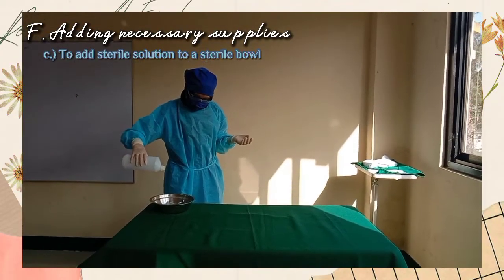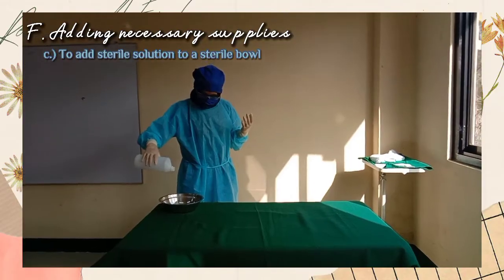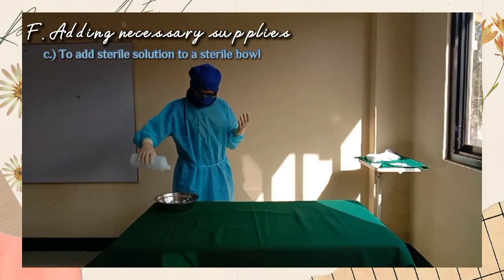Replace the lid securely on the bottle if you plan to use it again. Touch only the outside of the lid when recapping. Label the solution with the date and time of opening to maintain sterility.